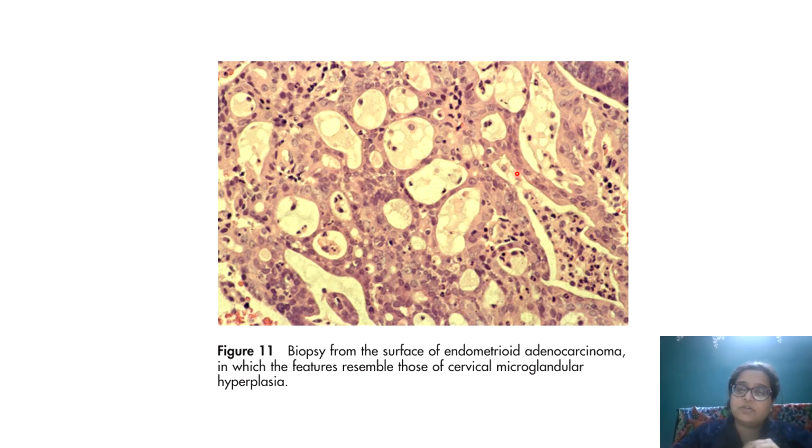In the previous case also, where you saw papillary hyperplasia looking very worrying, if I am not very well trained and I find that to be carcinomatous, I would write that I favor a carcinomatous process over a benign process. However, in view of whatever your confusing point is, a correlation, a deeper biopsy, and a hormonal profile, or whatever you need to advise, is recommended. My advice is always and always conclude your report. Please don't leave it to the surgeons or the physicians' understanding. They are not the pathologists, you are. Okay.